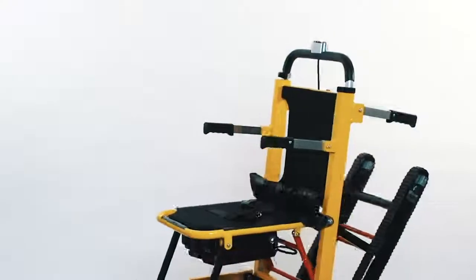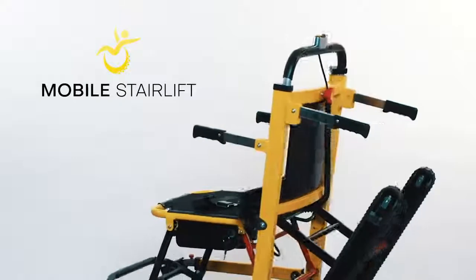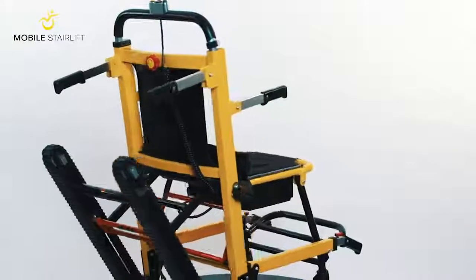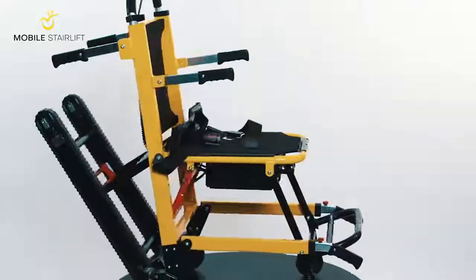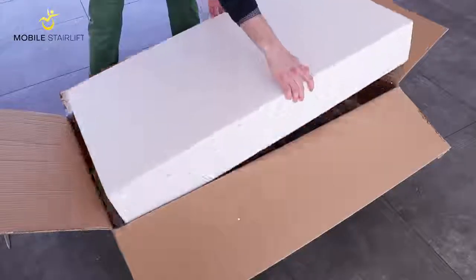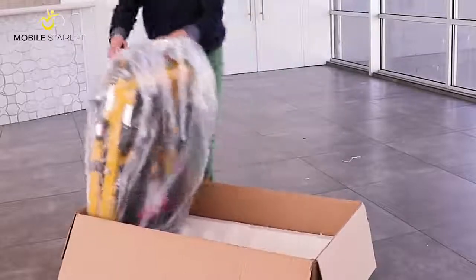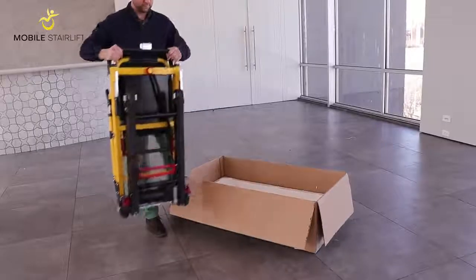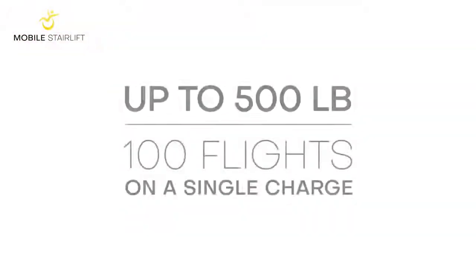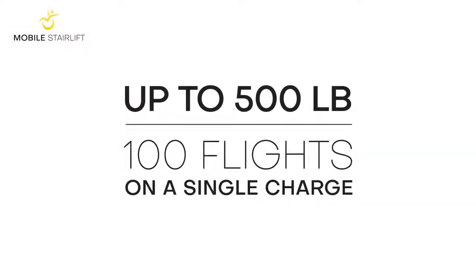Thank you for your interest in the newest innovation in ambulation mobility, the Mobile Stair Lift. This video will tell you everything you need to know to safely operate our product. The Mobile Stair Lift comes fully assembled out of the box and requires no other tools or assembly. This stair lift does not require pre-installed tracks and can carry up to 500 pounds as many as 100 flights of stairs on a single charge.